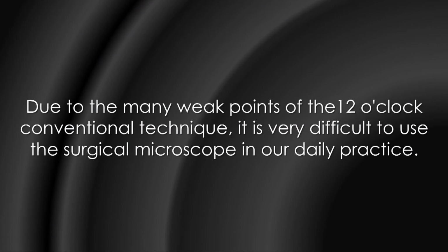These are the weak points of the 12 o'clock conventional technique. It is very difficult to use a surgical microscope in our daily practice.